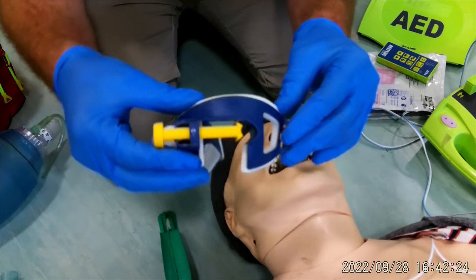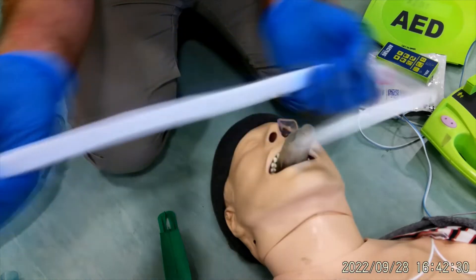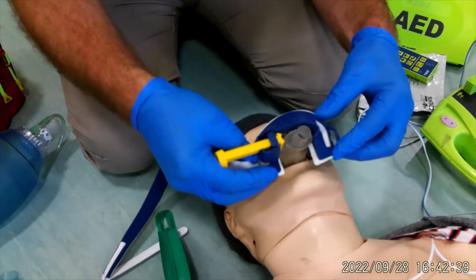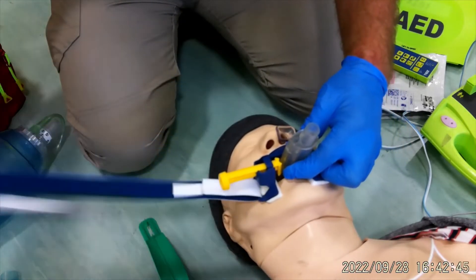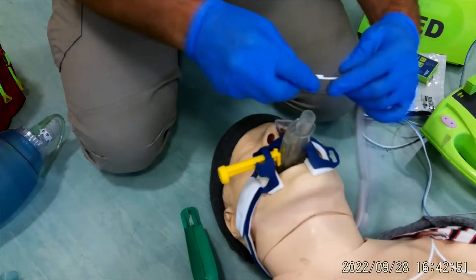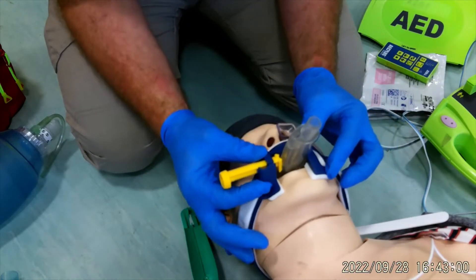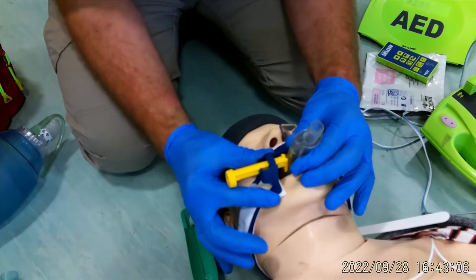I'm now going to clamp the i-gel in place using the Thomas select. Press the button on top — the yellow bar comes out. Get it open, make sure the bite block goes between the teeth. Use the window to watch it slide down the i-gel and go between the teeth, get it as flat as possible, then clamp it in place. Velcro that down, hold the i-gel where I want it, and screw the clamp in to secure everything.